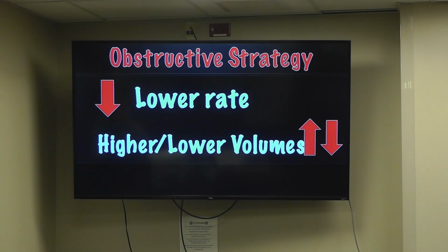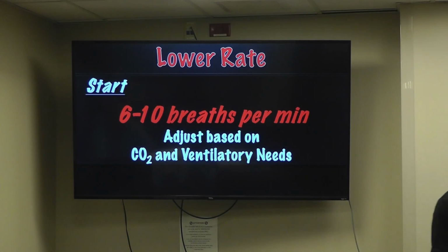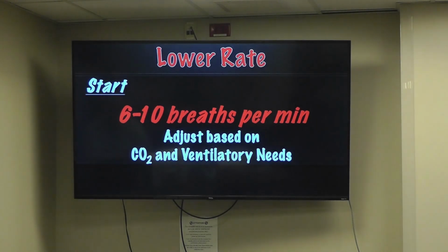And then the volume is going to be dependent on what we can get to maintain a minute ventilation. So we're going to start at a breath rate of around 6 to 10 breaths per minute on these patients. Always on the low side.